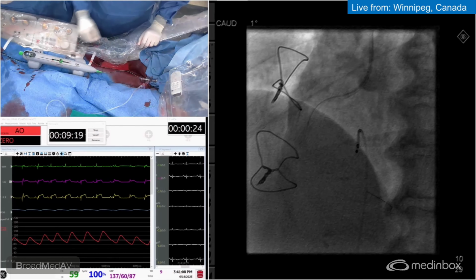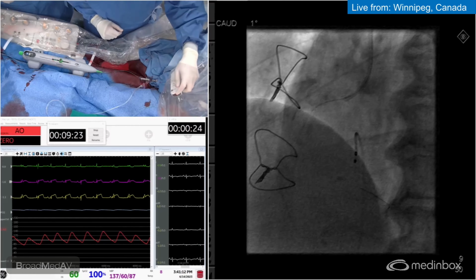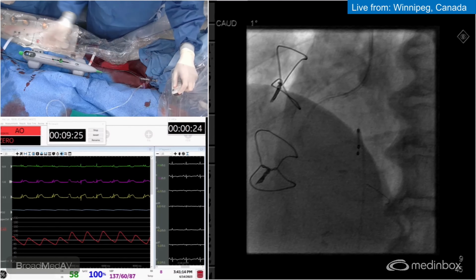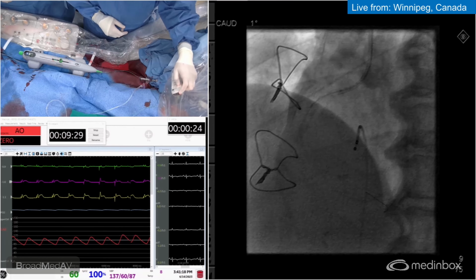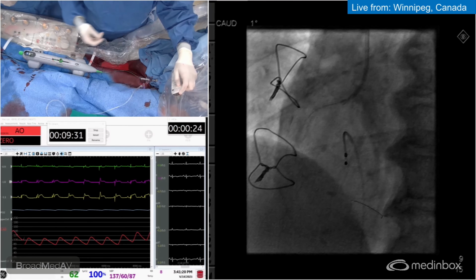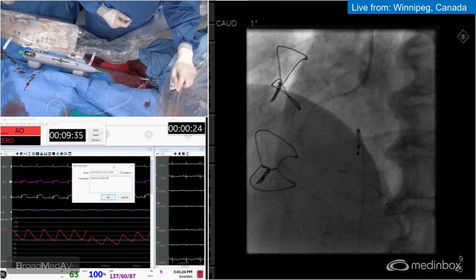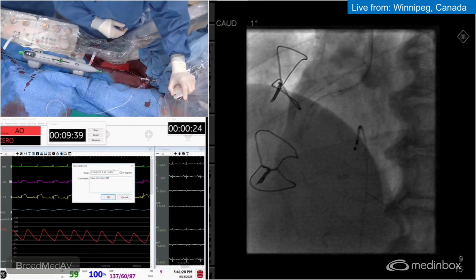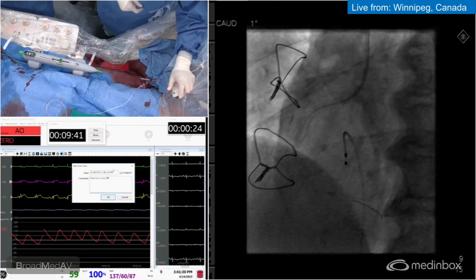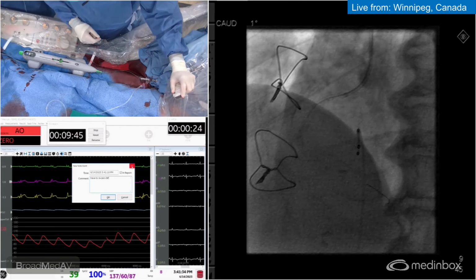Is it worth re-OCTing it? I think, just for the sake of time and all that, we should probably just take the NC balloon, see if it cracks. And then if that doesn't work, we'll have to think about other balloon-based modification. You can ask if he is having any pain. Cutting balloon is probably a reasonable option. I think it's got a 50-50 chance to work. I just think from a cost perspective, it might be more cost efficient to go to Shockwave.